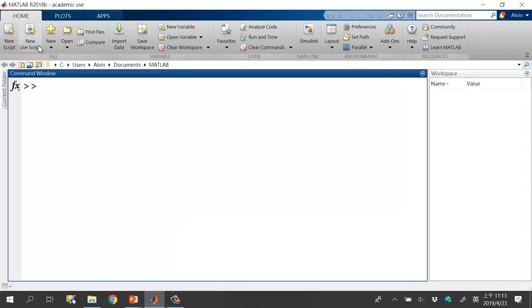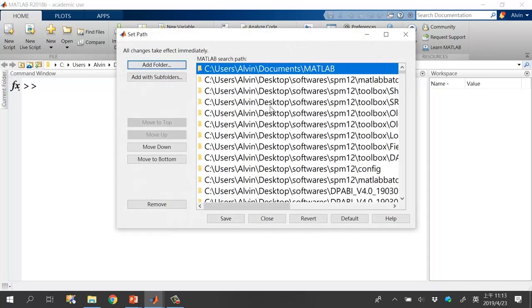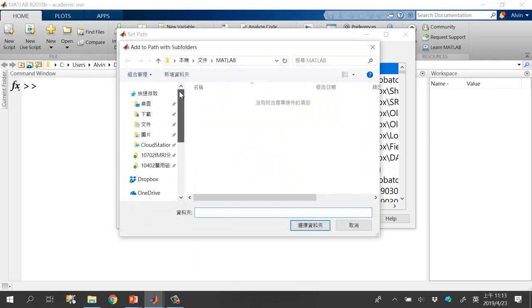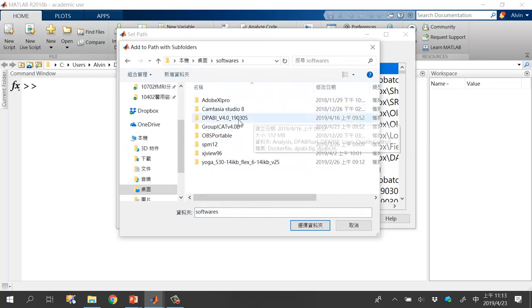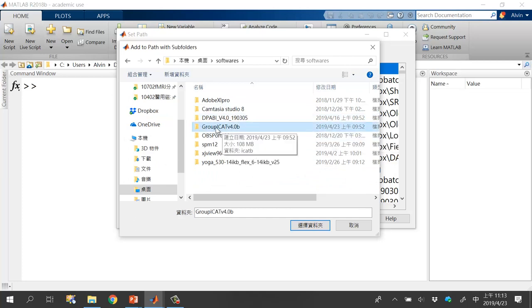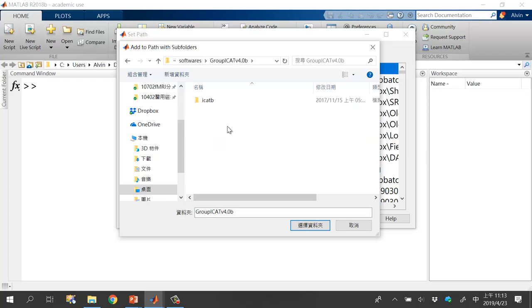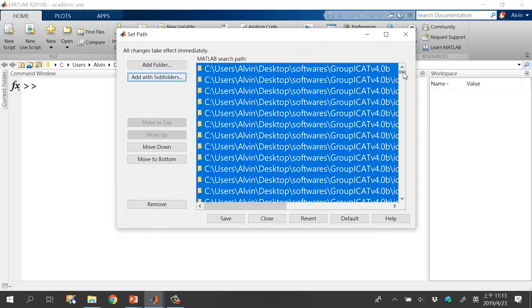Go to the MATLAB environment, click 'Set Path' under the Home tab. Using the 'Add with Subfolders' button, find the folder you downloaded from the website — group ICA v4.0b — and select it. You can see all the subfolders will be automatically included in the MATLAB path. Click Save and Close.